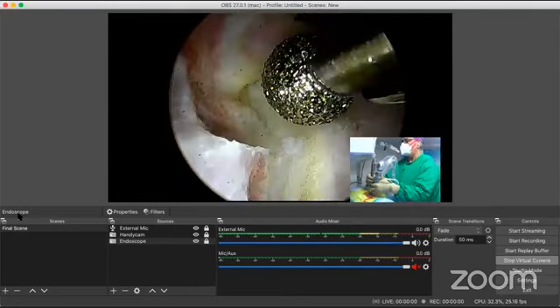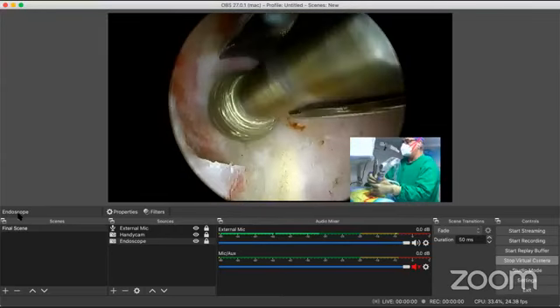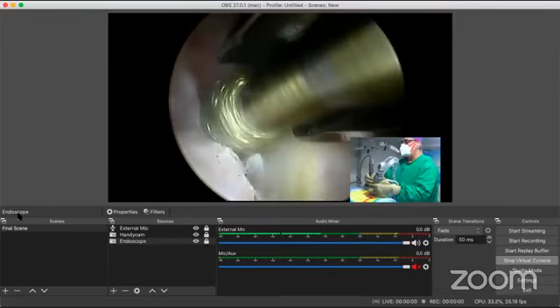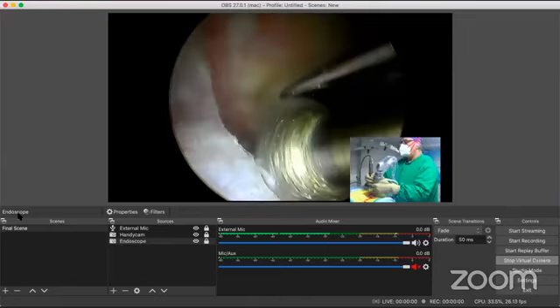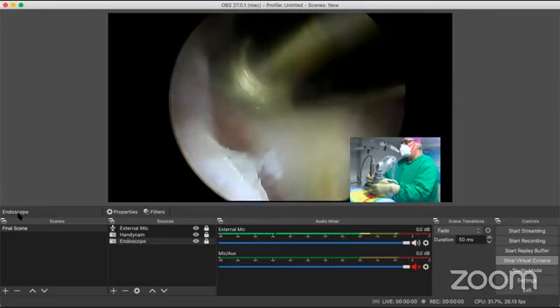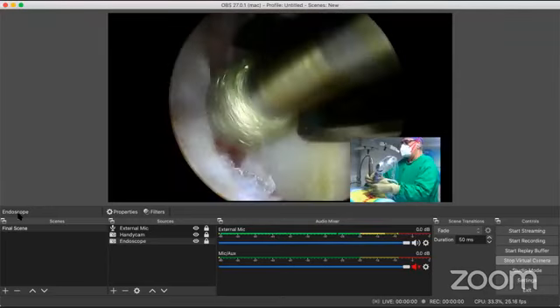Okay. Now we are going to start our burring a little more. Now this is a V point. Burr. Now the V point and the facet point both are now merging. So, bingo. This facet which I'm now burring will form part of the pedicle as we go up on the lamina.